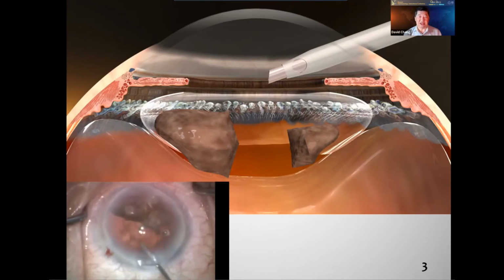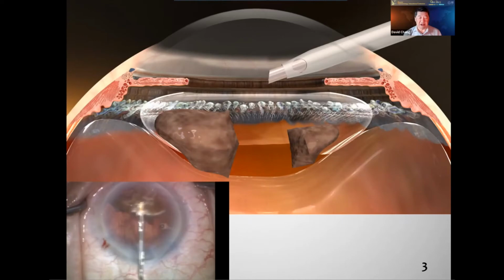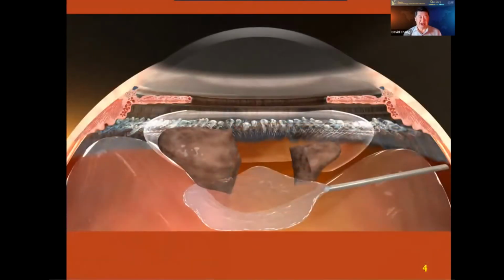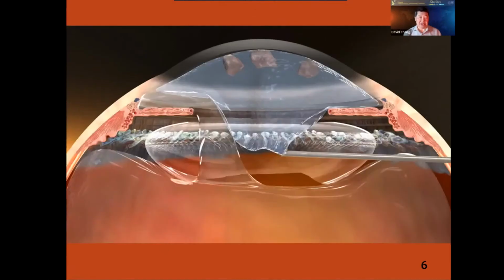This is the sort of instinct we have to avoid, and we need the discipline to say, look, there must be vitreous. I've talked about different techniques in the past. One of them is to use the viscoelastic cannula to push vitreous back and then to elevate any pieces upward toward the anterior chamber, where we can isolate them using a technique that I've called the viscoelastic trap.